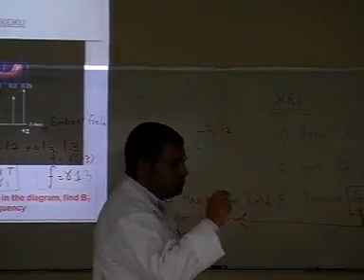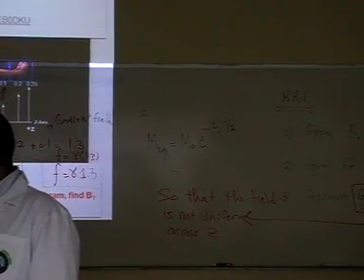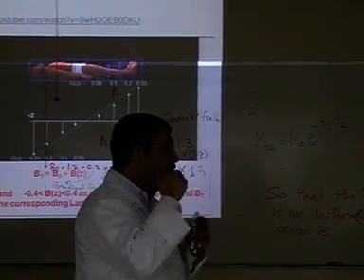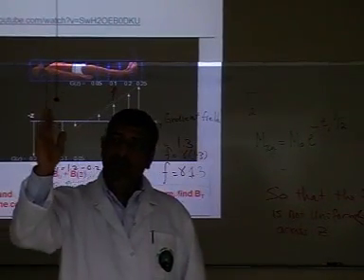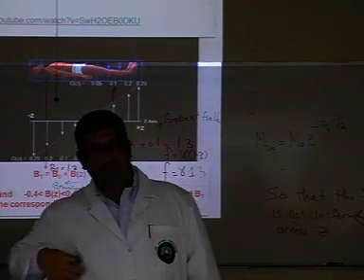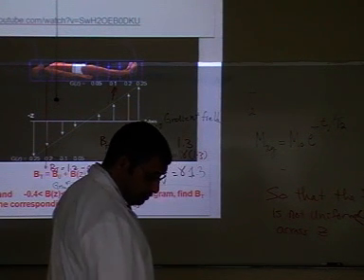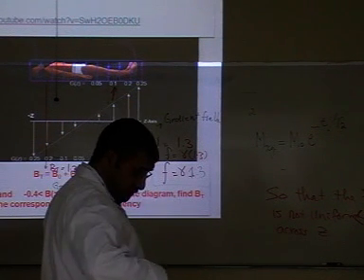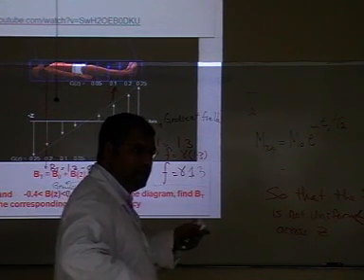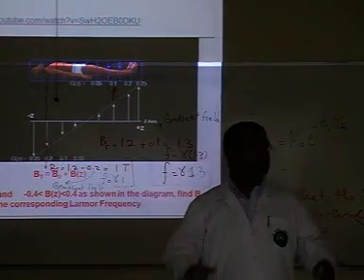So if you select some specific region, some specific point that you wanted to image, what is the magnetic field here? And by the way, the gradient field is known to you. So if you, as an operator, say, I wanted to select that region, you just go to your computer and select along Z, because that Z is known. For example, let's start from 0 at the bottom, and then I want 0.75 Z, that means here. In your computer, you know what that gradient field is. You add it to your zero field, and then you set the frequency. And then you're in business, right?